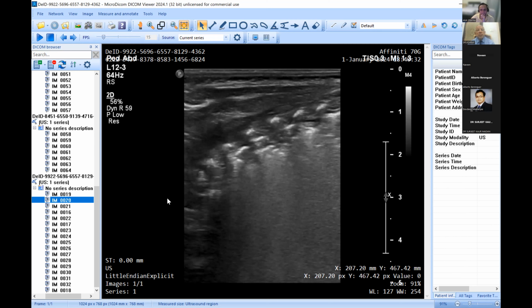What do you think? So this image actually, you can see multiple rib spaces. I think 1, 2, 3, 4 rib spaces at least, and you can see the pleura, which is not clean. Would you call this subpleural thickening? No. You're absolutely right, the pleura is not clean. You've got areas of pleura that are visible here, here, here, and then you have no pleura here. You've got a slightly darkish region there, and quite irregular consolidation here with some bronchograms with a linear shadow here. So this is basically consolidation with atelectasis and a B profile.